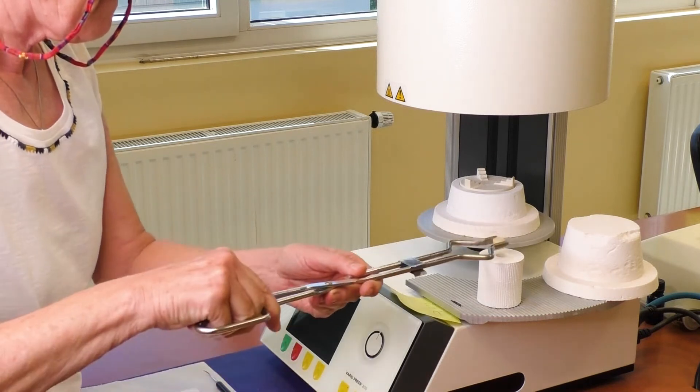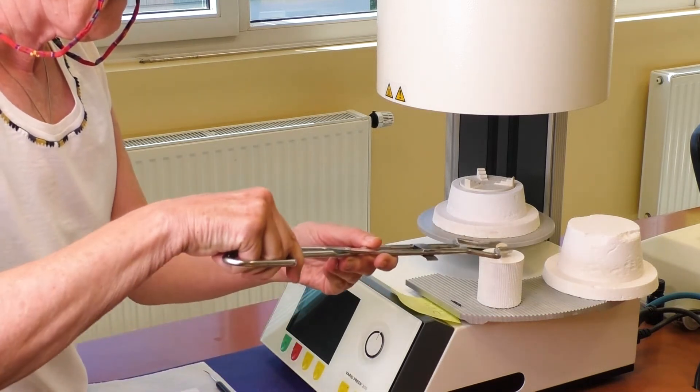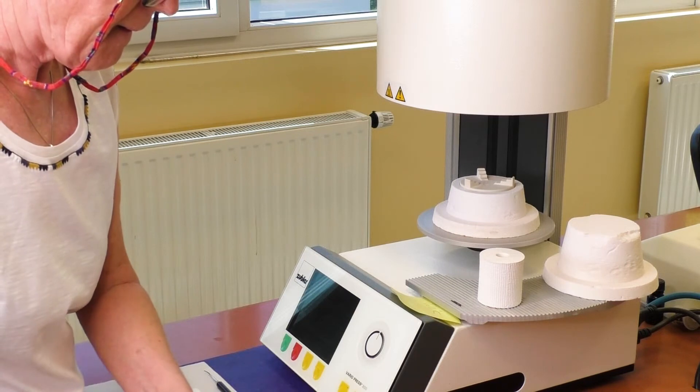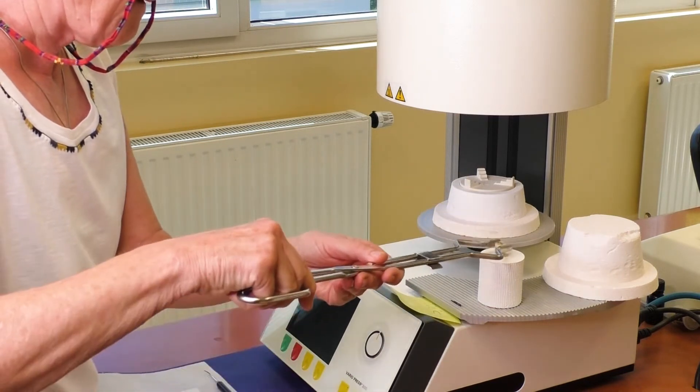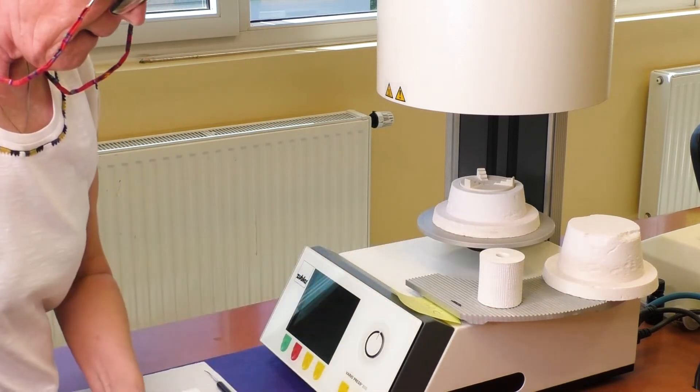When using two ingots, remove the logo print from the first one, which can be easily achieved by sandblasting. Otherwise, it can lead to discoloration.